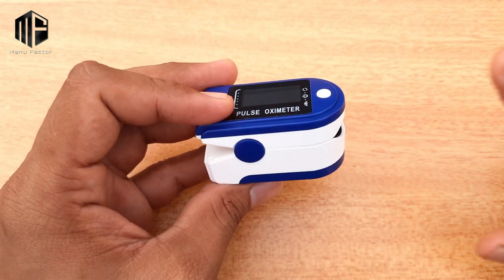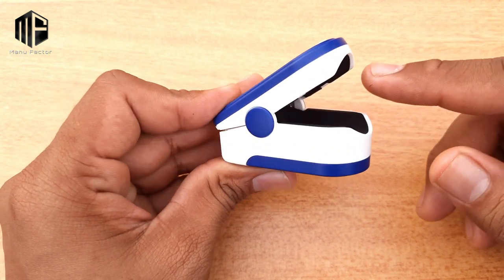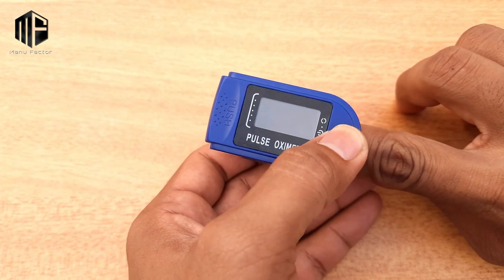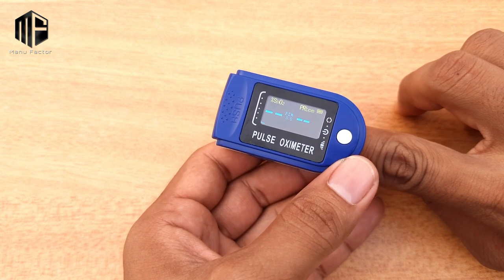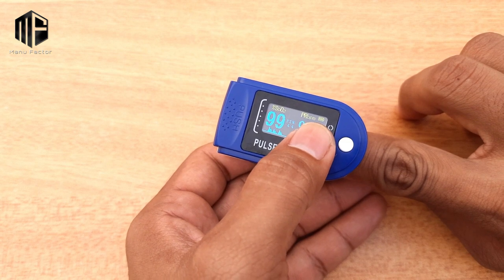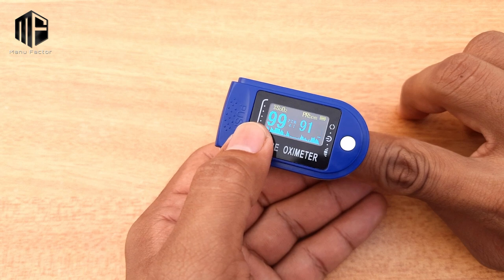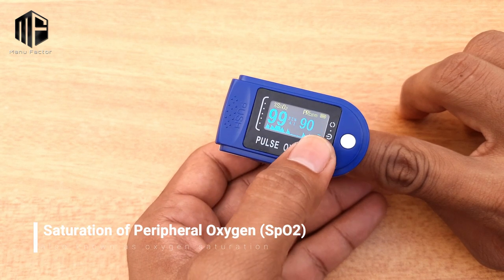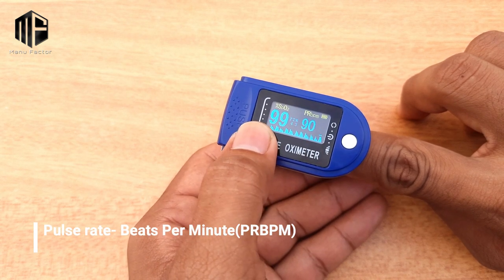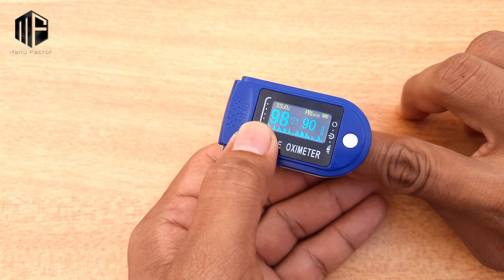You set the button, and there is a laser light at the fingertip. Then press the button and the readings will be displayed. On the display, SpO2 is 99 and the pulse rate is 90.